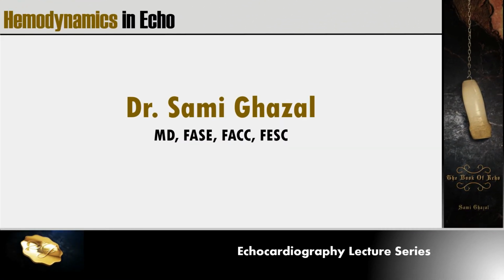Welcome to Echocardiography lecture series. This lecture is about hemodynamics and echocardiography. It is meant to be a one-stop shop for all hemodynamics and echocardiography. We're going to learn about volume calculations, shunt calculations, area calculations, as well as pressure calculations.